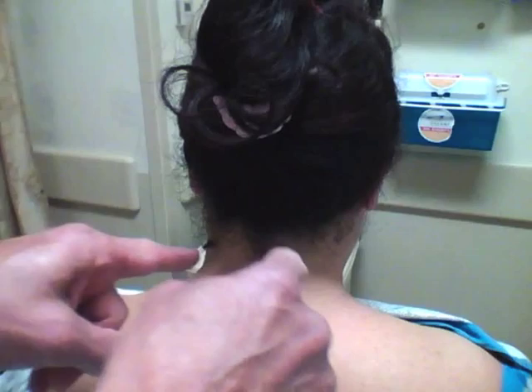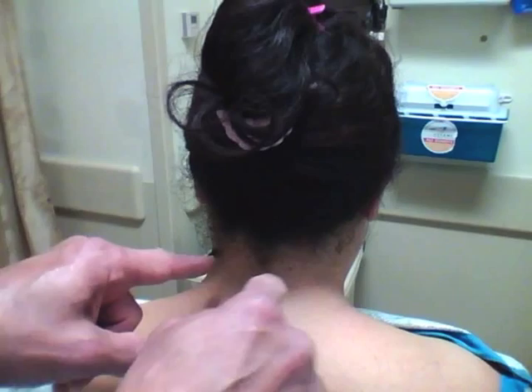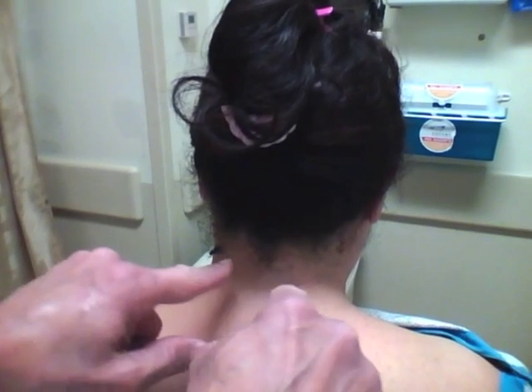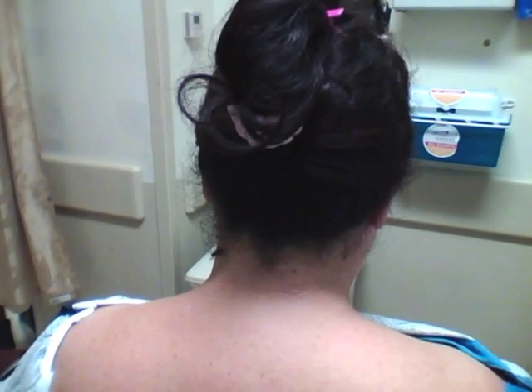What you're looking to do is block between C6 and C7. You want to feel for the spinous process and go about an inch off either side — so you're around C6, C7, an inch off either side. You're going to go in and put about a cc and a half of bupivacaine on each side.